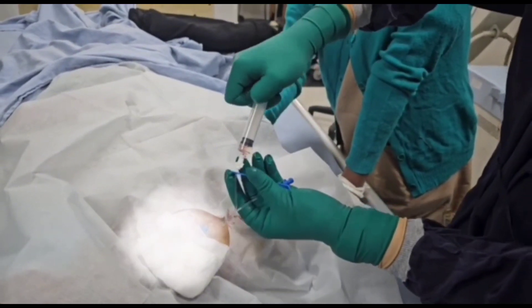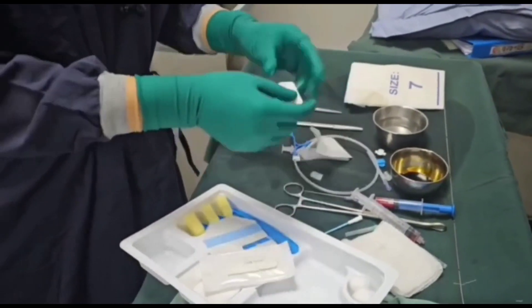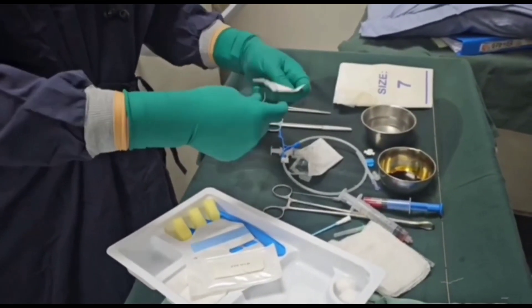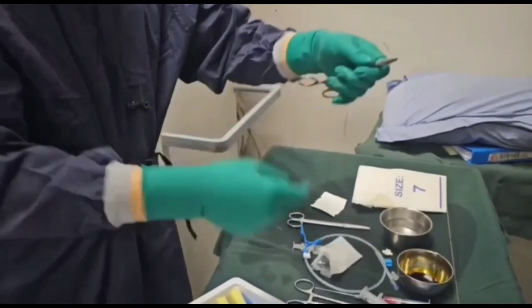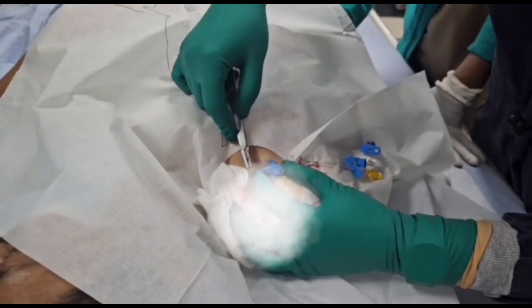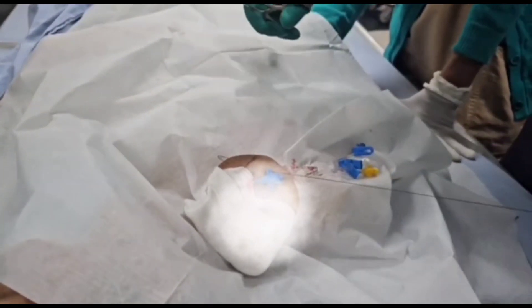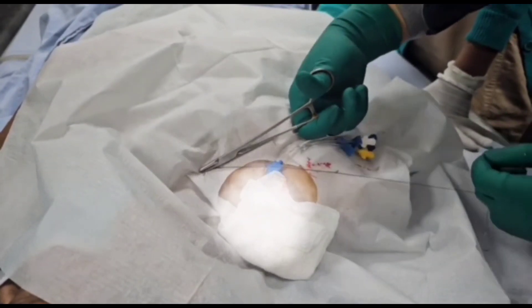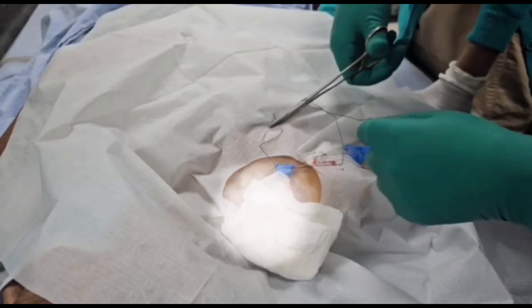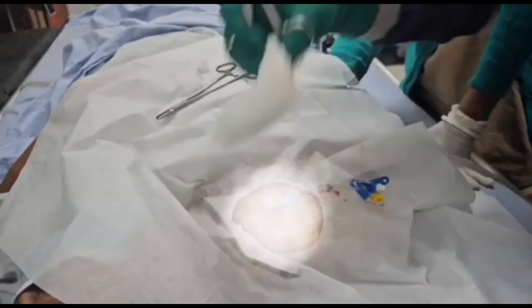We then fix the central venous catheter to the skin. We open a suture package and take the needle with the needle holder. We fix it at the hub which splits the central venous catheter into three lumens. There is a delta-wing shaped hub on the central venous catheter with two holes, one in each wing. We then give a surgeon's knot through the skin over these holes to secure the central venous line at the puncture site.